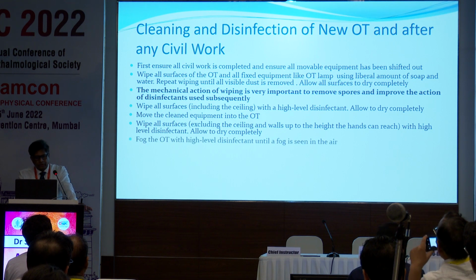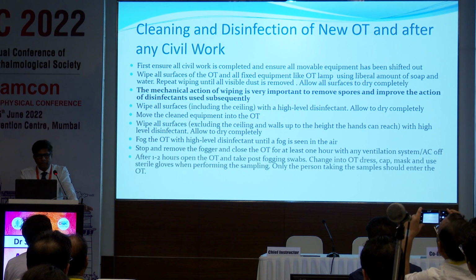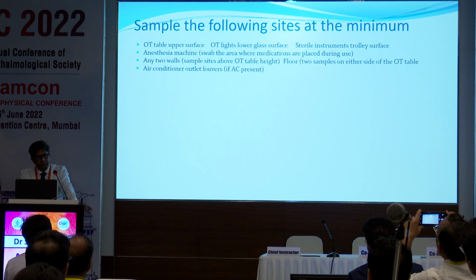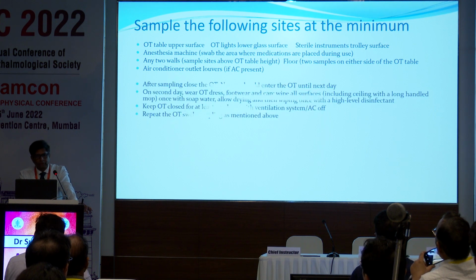Once this is dry, we have to think of fogging the OT if we are not using an HVAC system. And then we have to take the swab 1 to 2 hours after the fogging. Swabs have to be taken from the OT table surface, OT lights, the sterile instrument trolley, anesthetic machine, 2 walls, floor, and also from the air-conditioner louver.